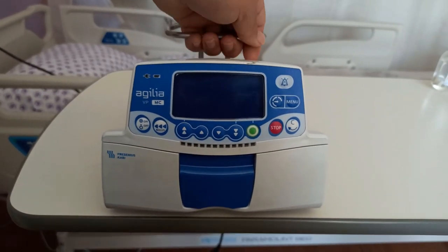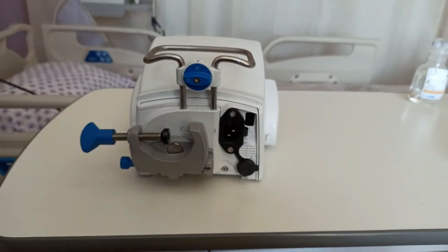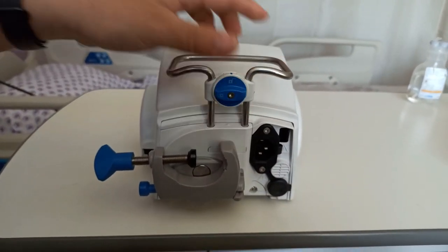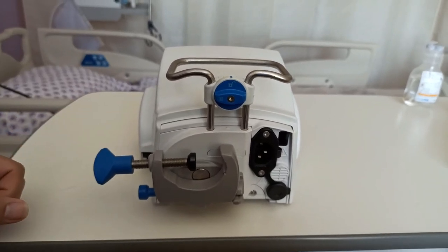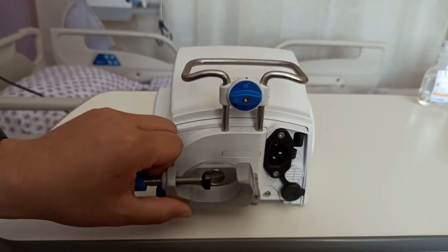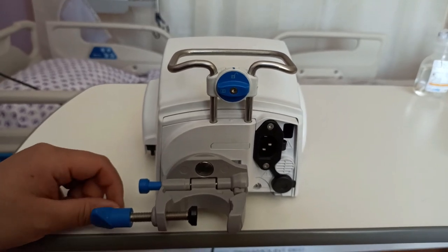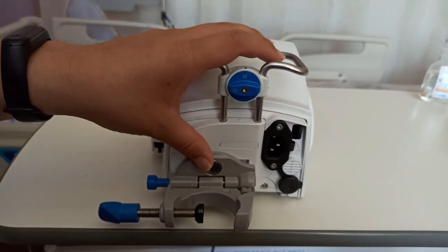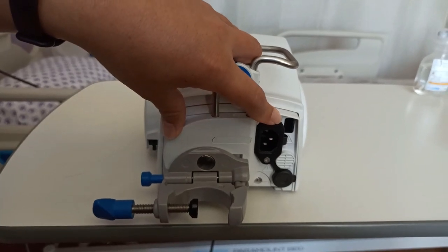Now we'll take a look at the back of the infusion pump. When you turn it around, you can see the clamp, which is used to clamp the equipment onto the IV pole, and the inlet for a power socket.